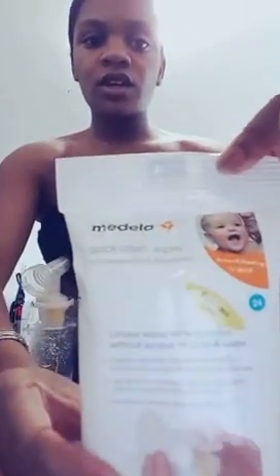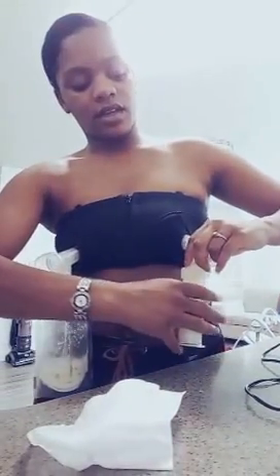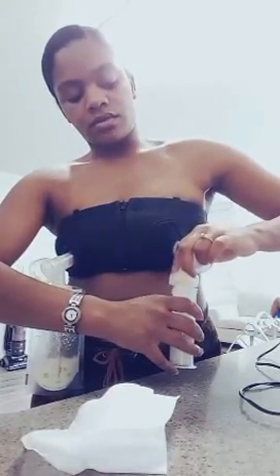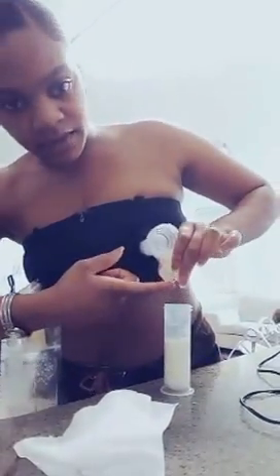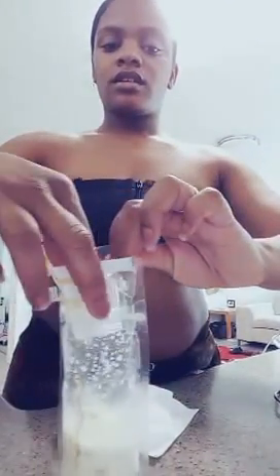Now I have my Medela Quick Clean Wipes. There's the wipes. I'm going to unscrew the tube. Sometimes excess milk gets trapped under this valve here. You can always lift the valve and dump it out. This is for cleaning all the parts. So I'm going to use this tube, put it right here, and we're going to unscrew the connector on the bag. Put it there.